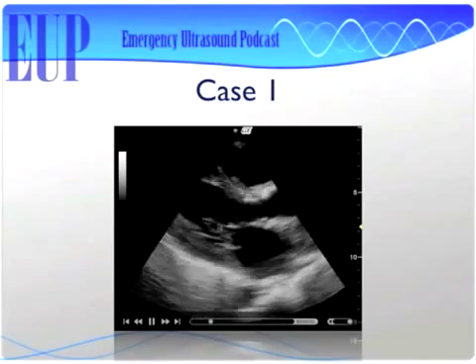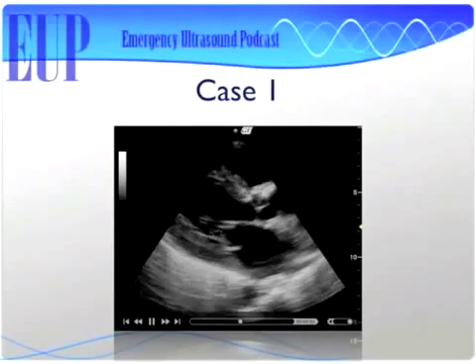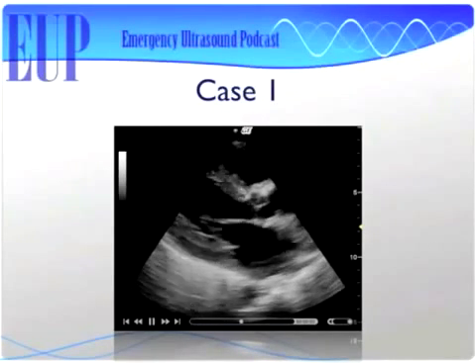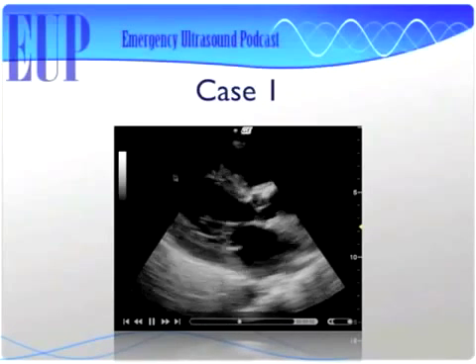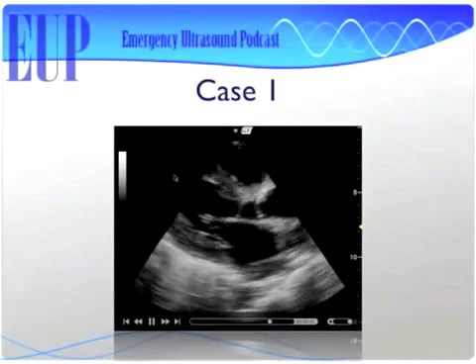That anterior leaflet of the mitral valve isn't flapping enough and not getting close enough to that septum, and that's actually a pretty good indicator that somebody's got decreased cardiac function. So I agree with you. I think that's probably true. It just doesn't look like it's squeezing right. Can we look at this left ventricle and say one portion of it seems to be squeezing less than another portion? I think yes.